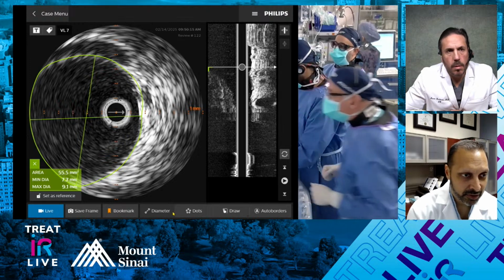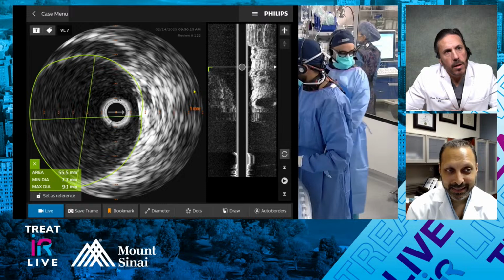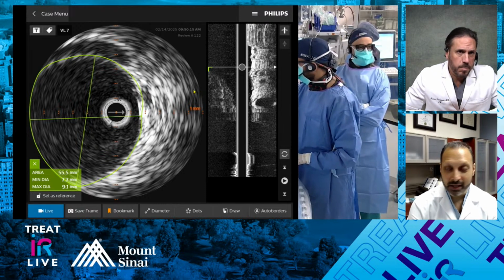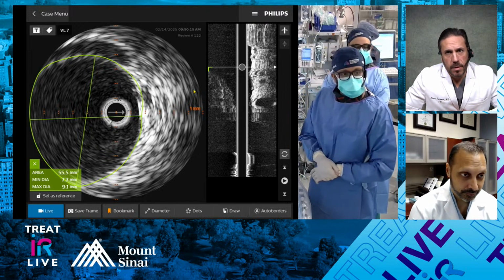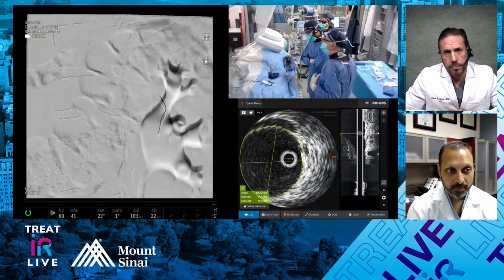Well, that's saying 7.7. Is that right? Minimum diameter? Yeah, it is, but I don't think we're going to... Can I have another one, a 7 by 15, please? It's a little ovoid in shape, the way it was measured, right? Probably go with the 7.15. Yeah, I still would go with a 7 here. You could maybe take it up more, but I don't even think you would need to. I think going to 7 would be fine.